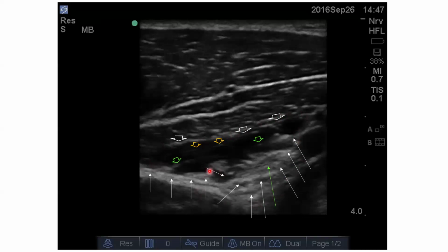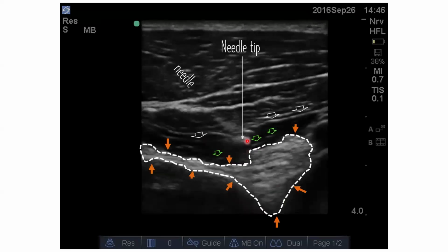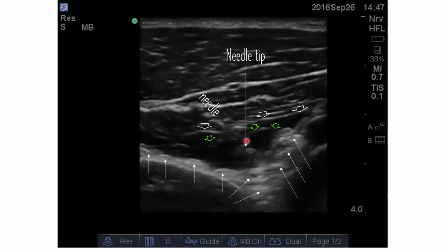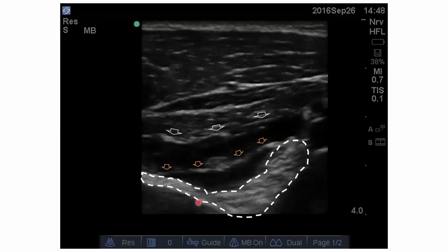So this is very important: the local anesthetic penetrates more inside when you start injecting, and you'll always find I have not moved the needle tip. The needle tip remains the same here, and in the previous slide it remains the same. You start injecting, it raises the sleeves of the fascial layers. Now you can see the entire sheath which is elevated. This is one compartment, entire one compartment. This is the second compartment of injection.